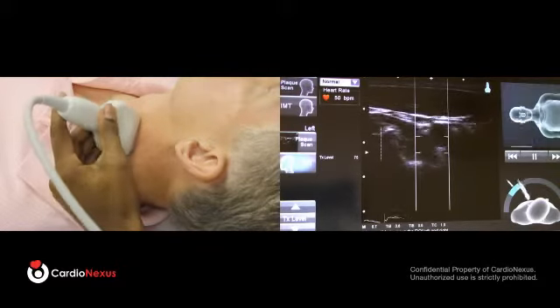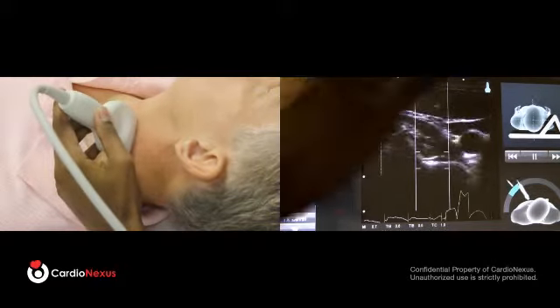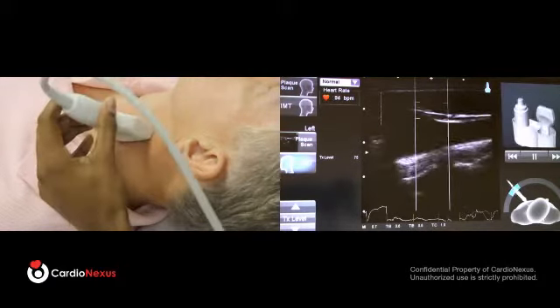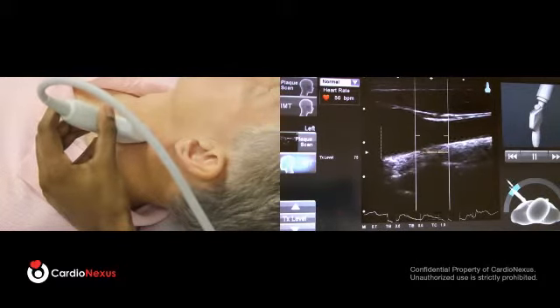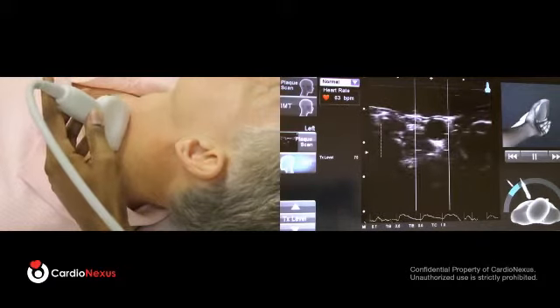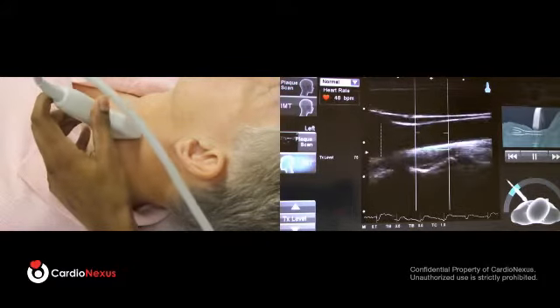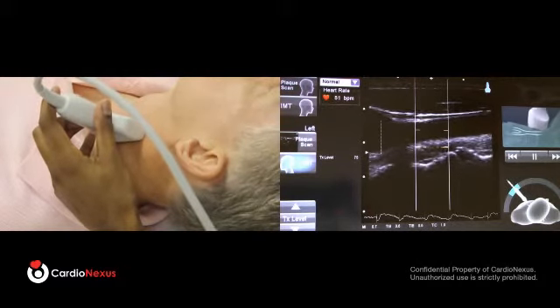So on the IMT measurement, there are three movements that you'll make. The first movement, keeping your eye not on the ultrasound screen, but on the probe and your hand, is simply rotate the probe more or less 90 degrees, keeping the artery mark, this dimple, facing up towards the patient's neck. So again, from this cross-sectional view, starting low on the neck, once you've identified the carotid in the center of the ultrasound screen, simply rotate the probe 90 degrees so the artery mark points towards the patient's head. More or less, it will align with the patient's neck.